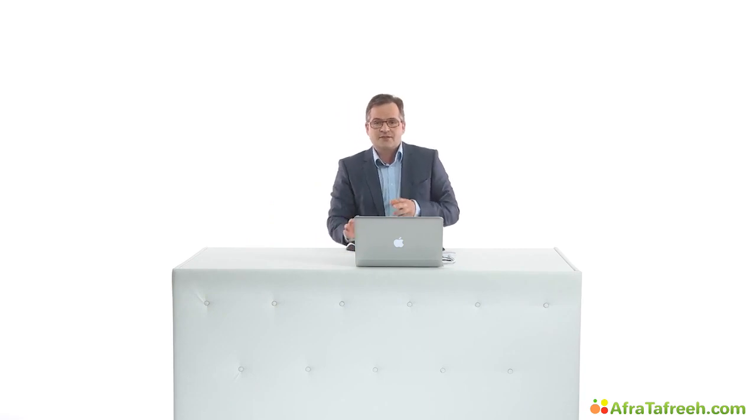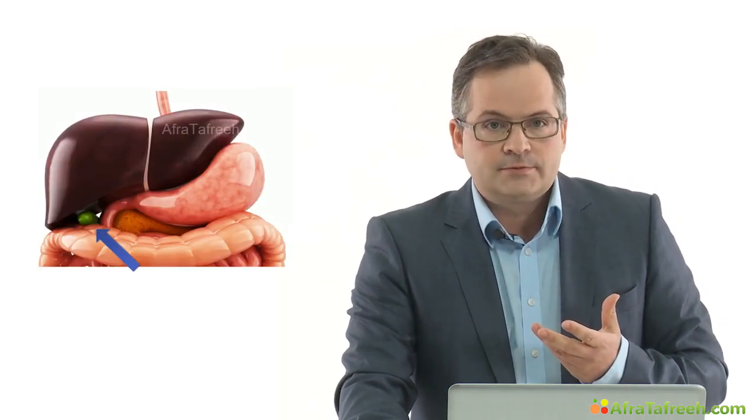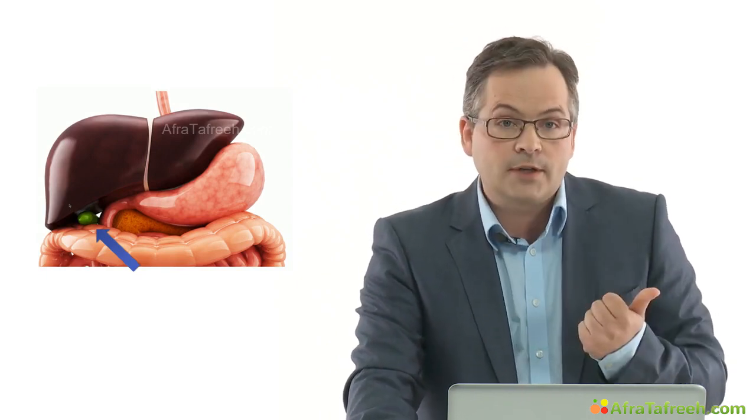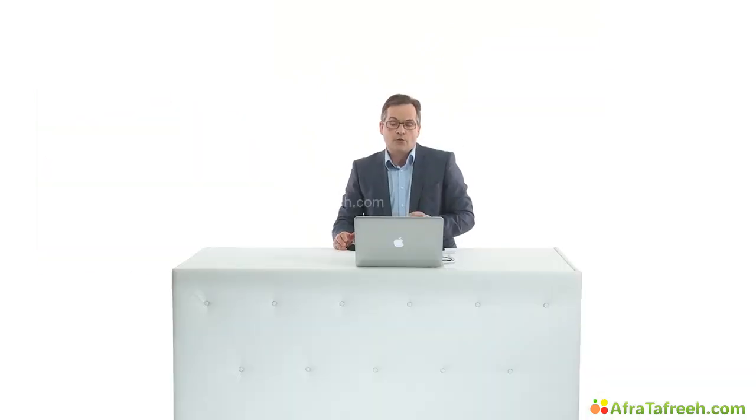In order to find the gallbladder in every patient, we need to have some experience and patience. We will show you a number of ways of examining and some tricks, so that you can be sure to find it. There are various methods of finding the gallbladder. Depending on the patient, it will be easy or not so easy. The whole organ must definitely be depicted on the screen. Now, let's go on with scanning.